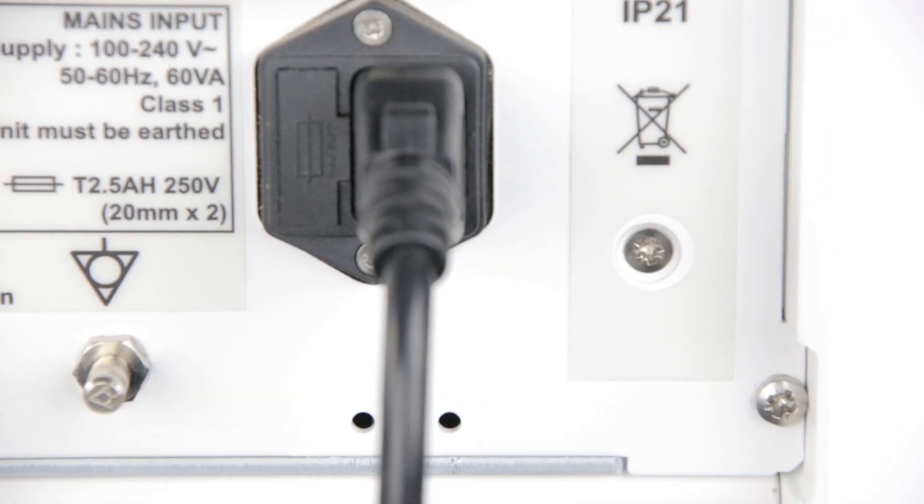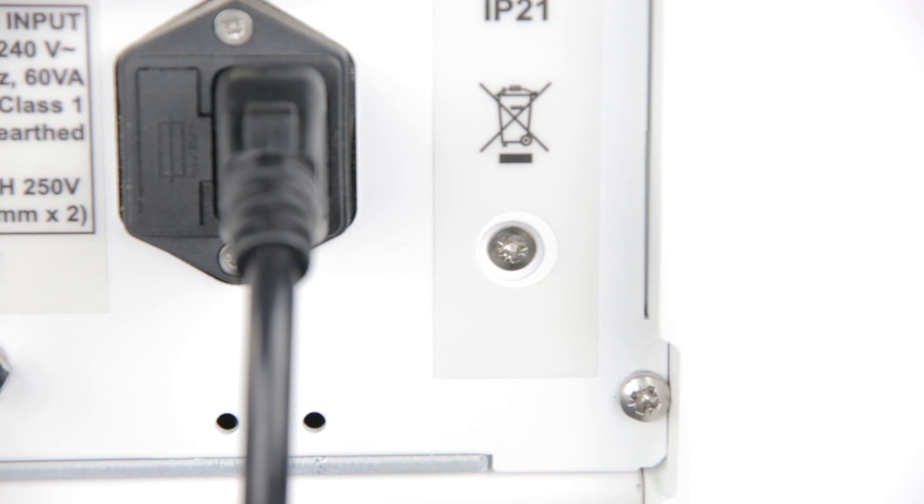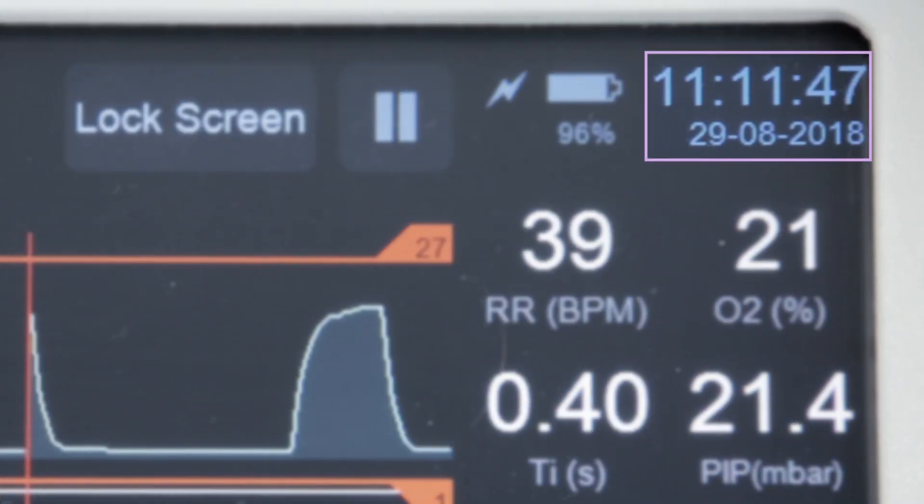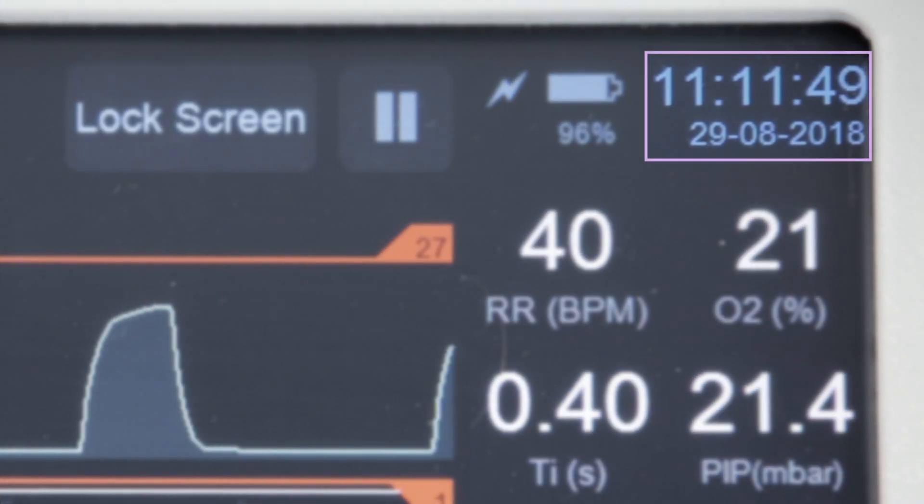Battery charging area: When connected to the mains, a lightning symbol appears. A representation of the battery with its percentage charge underneath will also be shown. The top right corner shows the time and underneath the date.